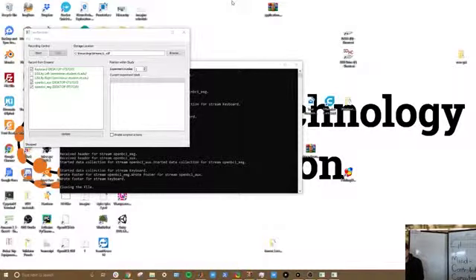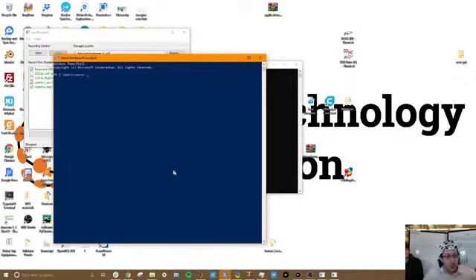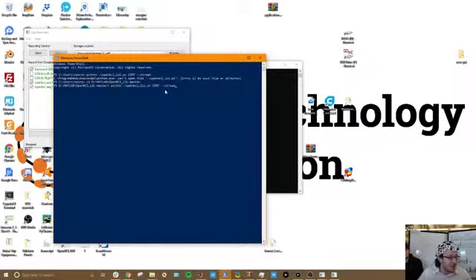So this is what happens if your OpenBCI happens to have a freak moment where it decides to just not be connected anymore. Which is very likely. It can happen sometimes. So I usually recommend that you open up the OpenBCI GUI when this happens, just to verify that the connection is still working. But you can see I'm not in the right directory, so just give me a second. I am not pressing the key I thought I was.